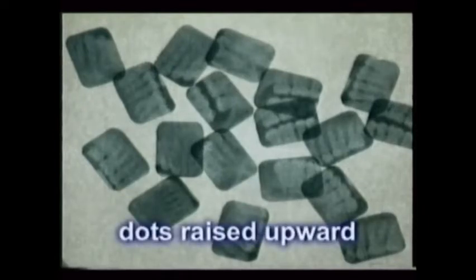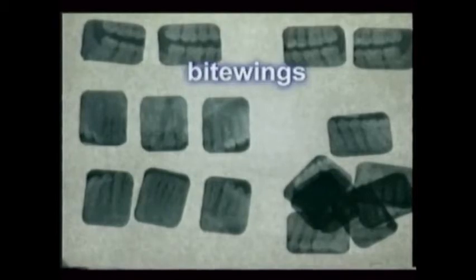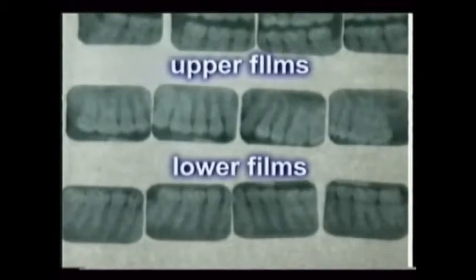First, place all of the films on a viewer box with the dots raised or facing upward toward you. Next, group the films separated into posteriors, anteriors, and bite wings. Then, slide the upper films to the top of the viewer platform and lower films to the bottom.